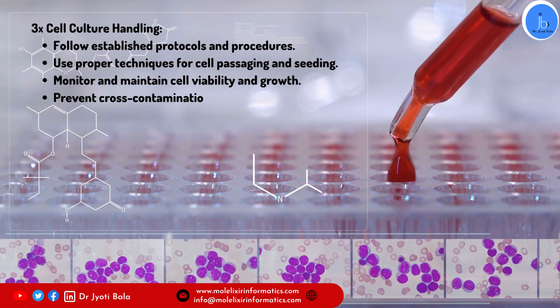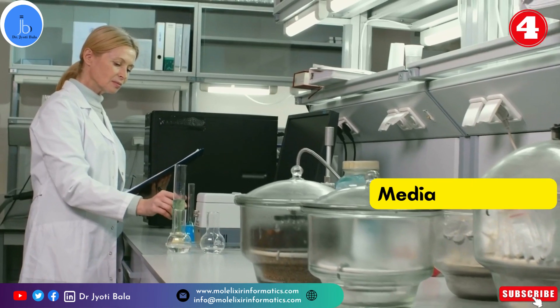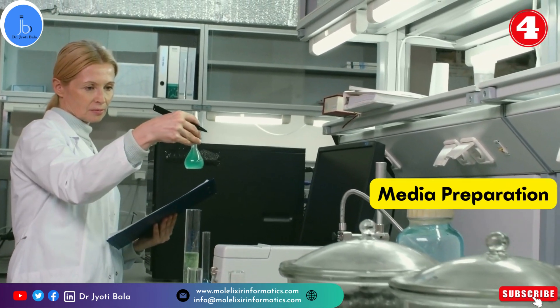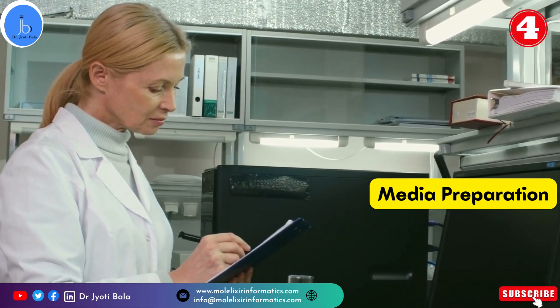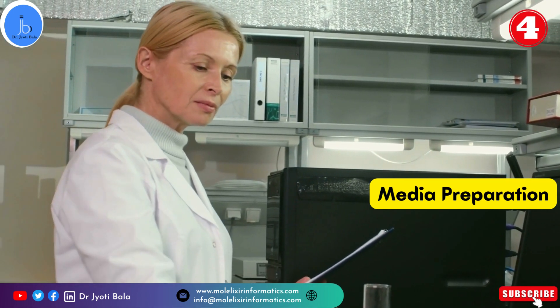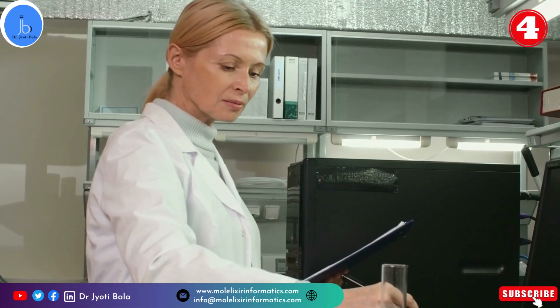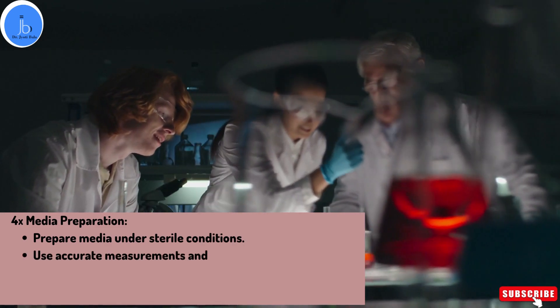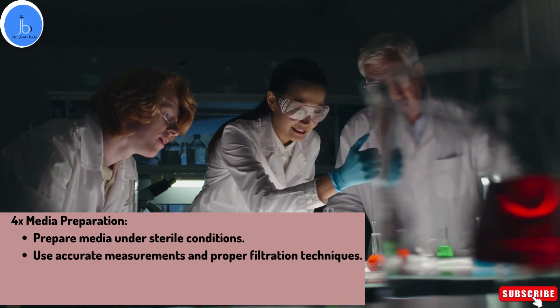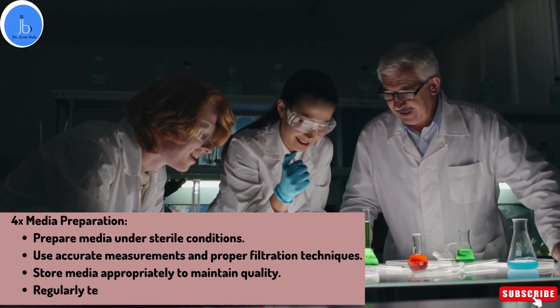Media preparation is a crucial requirement in a cell culture lab. Preparing media correctly is essential for maintaining healthy cell culture. Start by ensuring a sterile environment when preparing media. Accurate measurement and proper filtration techniques should be used to avoid introducing contaminants. Storing media appropriately, such as in a refrigerator at the correct temperature, helps maintain its quality. Regularly testing and monitoring the media for contamination is also a crucial step.